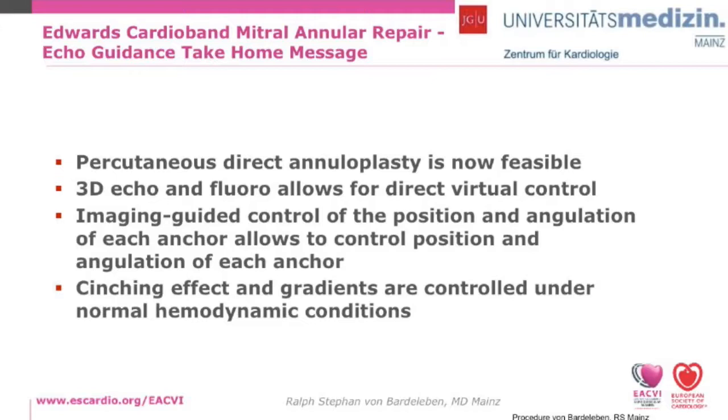I think those are the most prevalent possible complication situations, because, of course, these patients are anticoagulated during the procedure. But we had no single case of bleeding complication in the esophagus in our more than 1,000 procedures with the TOE. So I think this is also very, very rare. But you have to make sure that your TOE system is straight when you pull back, get into the ventricle, or pull it out. I hope I was fast enough. Yeah, thank you so much.